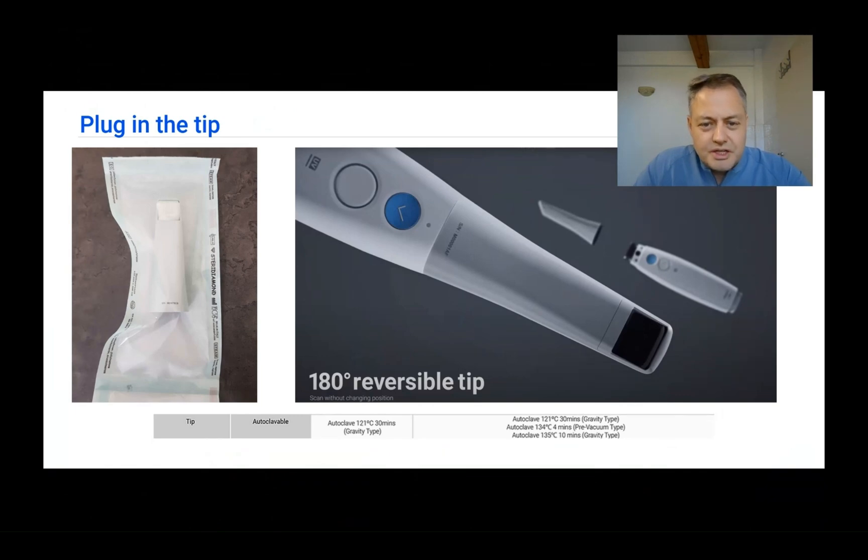Before starting to use the scanner, you need to remove the lid of the scanner and place a tip. As you can see on the right, tips can be used with the mirror facing down or up, as they are 180-degree reversible tips.